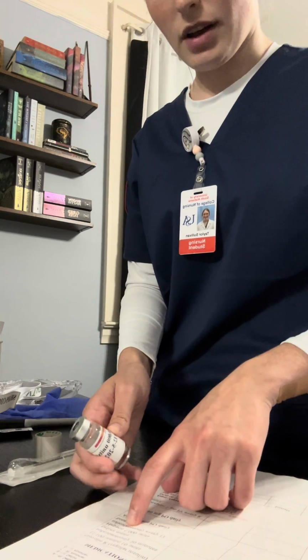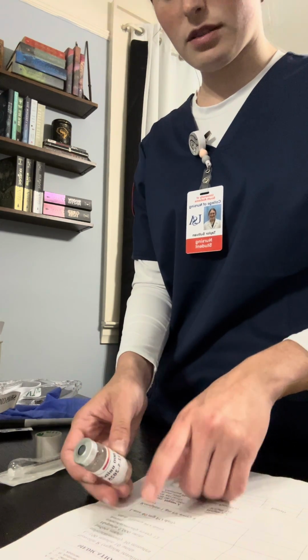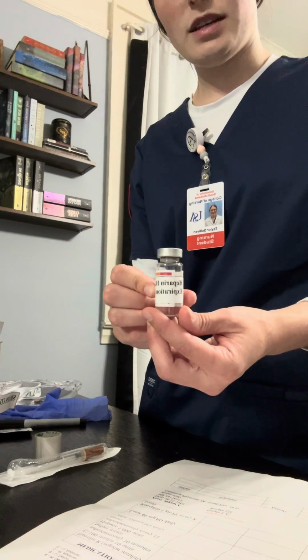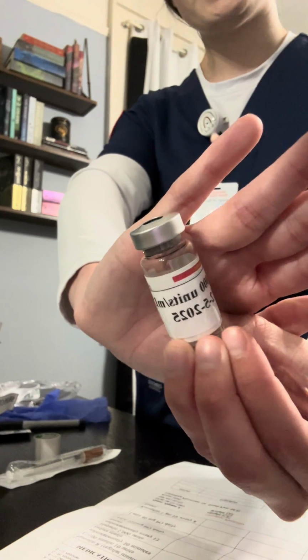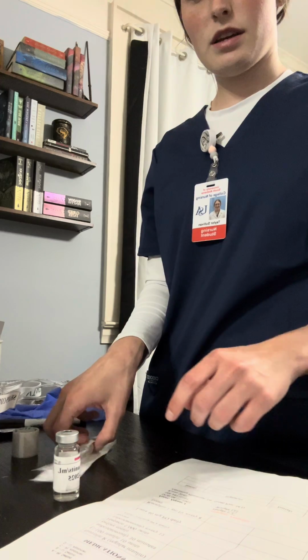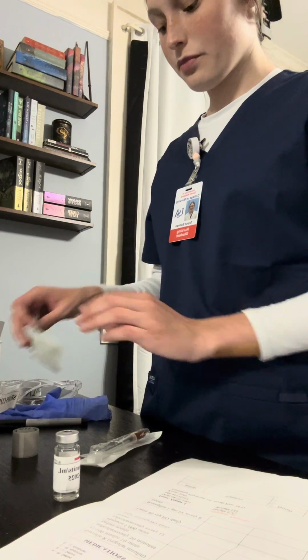So I've got heparin, 5,000 units, 10,000 units per milliliter. This is in date. The expiration date is 12/5/25, so we're good to use this. It is subcutaneously, so I'm going to use a tuberculin syringe.